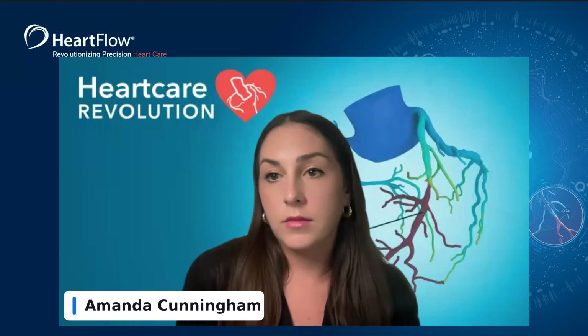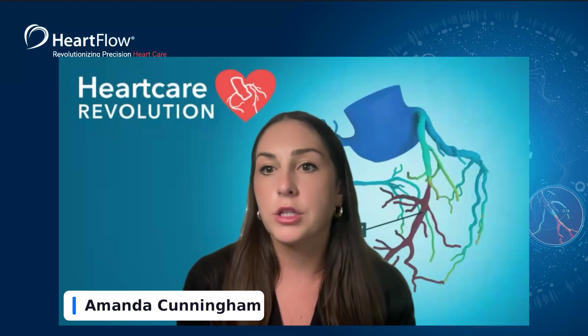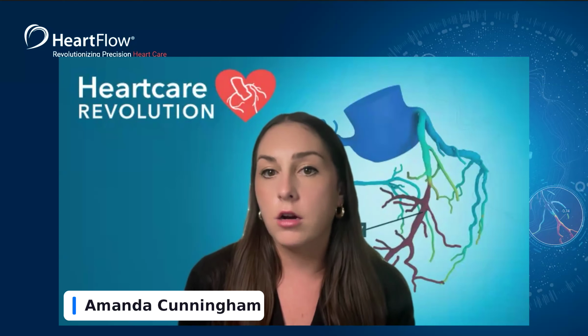Yeah, you literally said it perfect. So there are lower end scanners, older scanners that can do great things. You just have to be very vigilant with your heart rate control, but focusing on scanners that probably have better temporal resolution is going to provide better, less artifact, better quality scans. But yes, beta blockers are always needed. Even if you have the latest and greatest scanner, we always like to reference the SCCT guidelines that say heart rates that are 60 and below generally have better image quality.